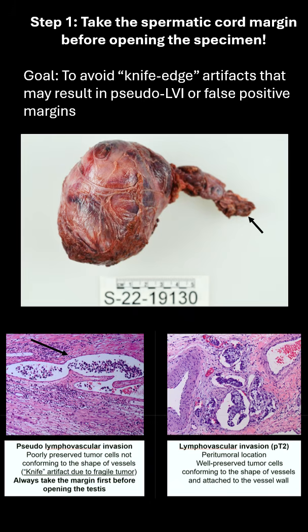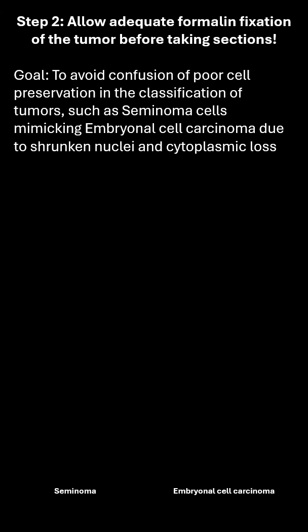as well as at different margin planes, and can result in a false reading, while a true lymphovascular invasion has very well preserved cells, often assuming the shape of the blood vessels with an endothelial attachment at one of the planes, and often you see red blood cells within these spaces.